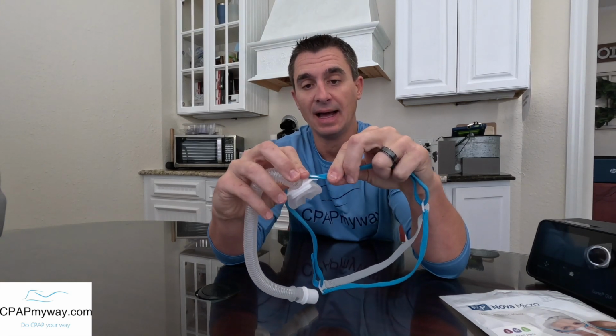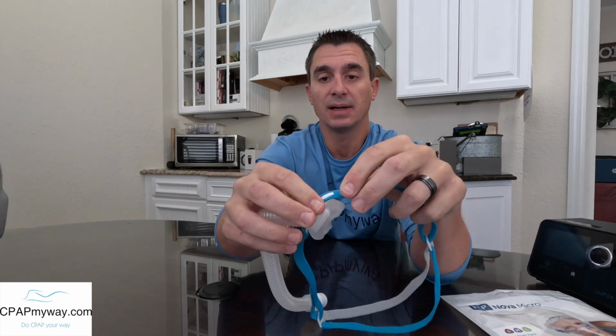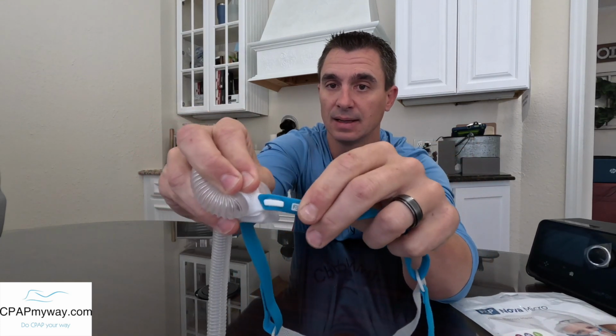So it hasn't stretched at all for me messing around with it or washing it or dealing with it, but it is different. There's no snaps, no anything. You're just pulling it off of two little hooks there, right? So hook on the front, hook on the back. And the way you do it is you hook it on the front first and then pull it around the back and snap it on there.